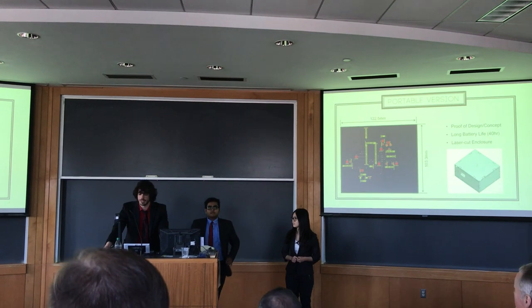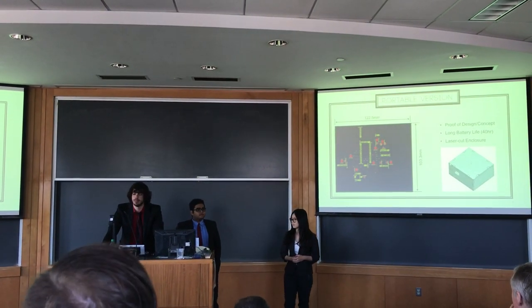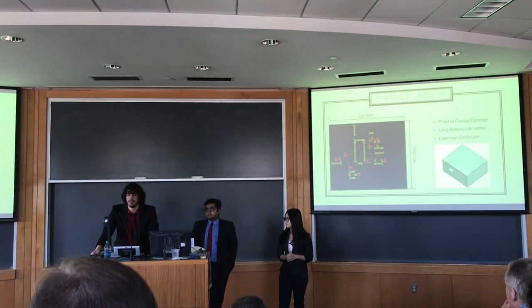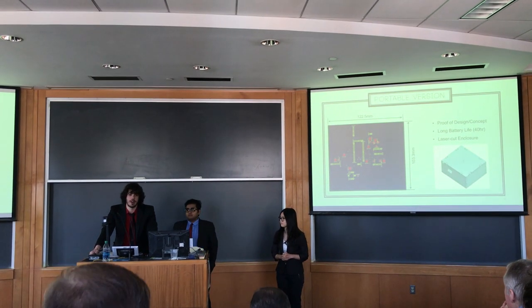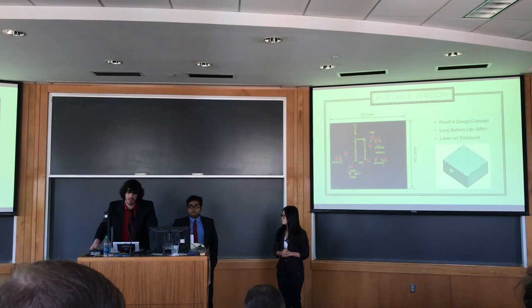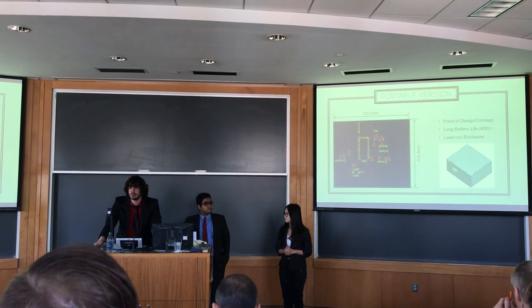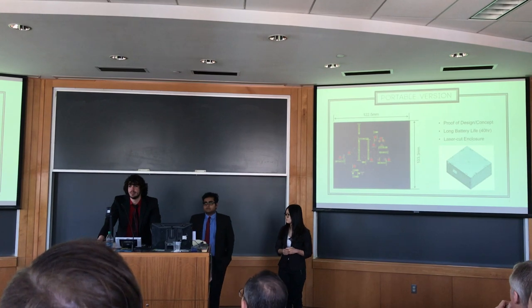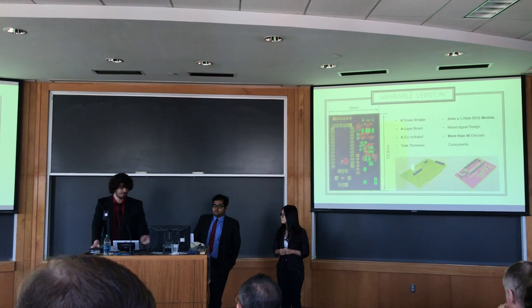The first version of the device we designed was intended as an early prototype and proof of concept. The PCB was made intentionally larger than necessary for easier routing, assembly, and debugging. Although this is not a production design, it could also function in a hospital or healthcare setting. An oversized battery was selected to accommodate a full day of nearly continuous sampling. Laser-cut acrylic was used for the enclosure, as it is cheap and easy to process, and holes cut inside allow physical access to the sensors.